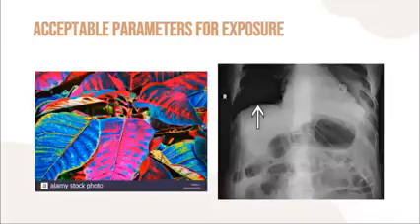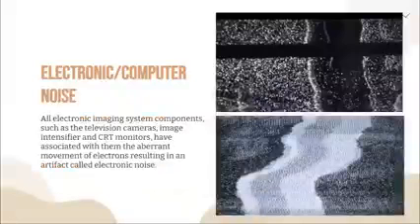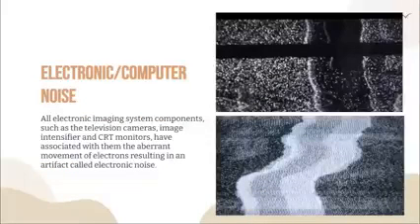So, to continue, let's go to noise. The preceding slides were a bit easier. The next one is electronic or computer noise.